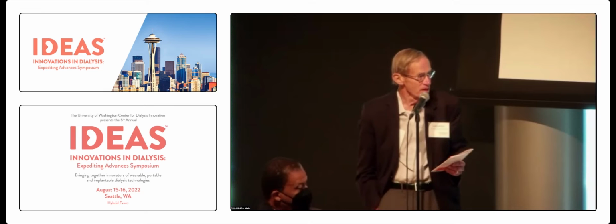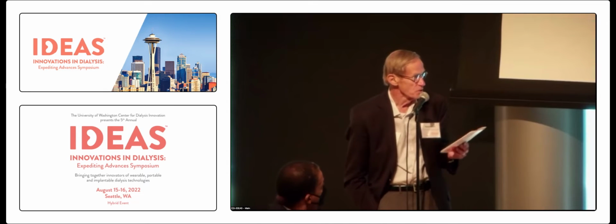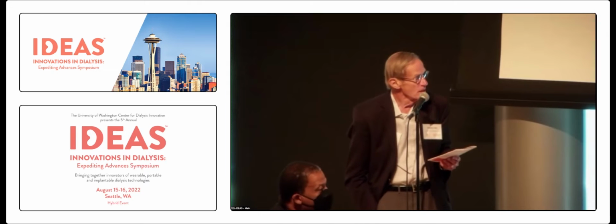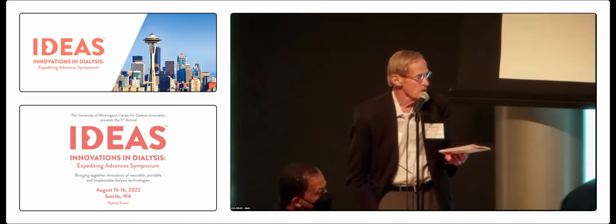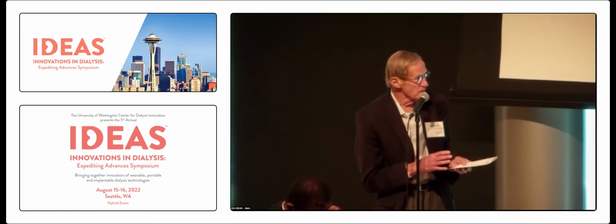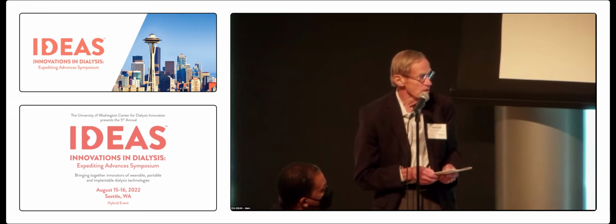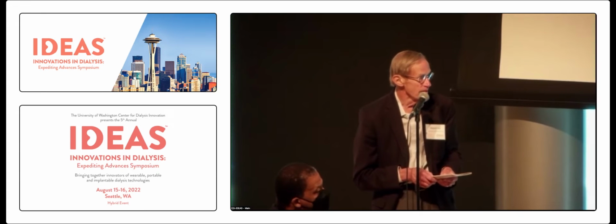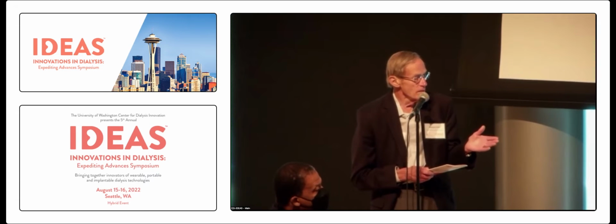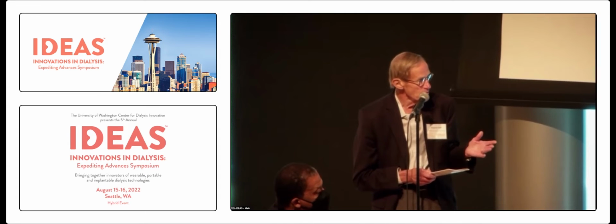Hi, Steve Ash again. A comment related to Vivek's presentation. Excellent. But the comment is that I think this idea of the outside-in dialysis can be a tremendous improvement in biocompatibility. And you showed that the clearances were approximately the same, whether it was outside in or inside out.